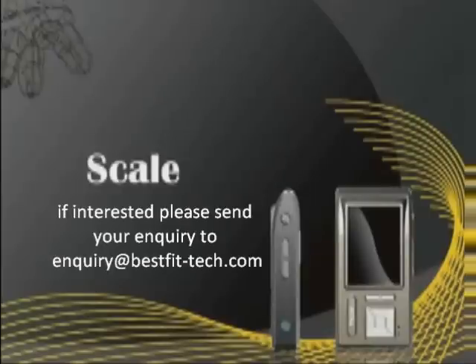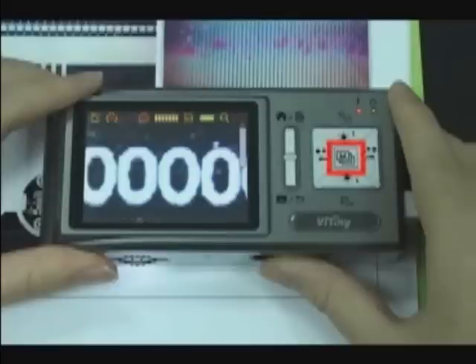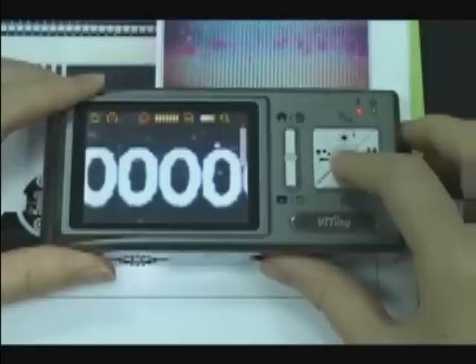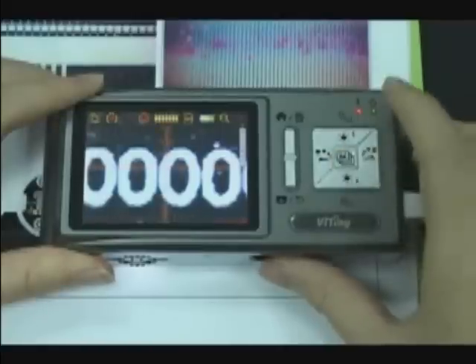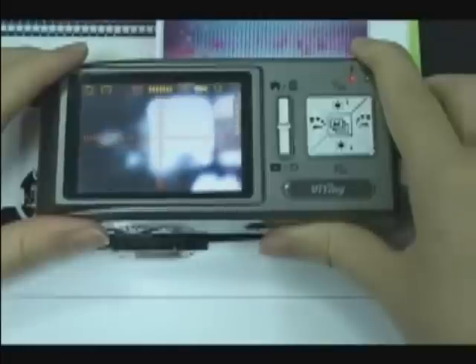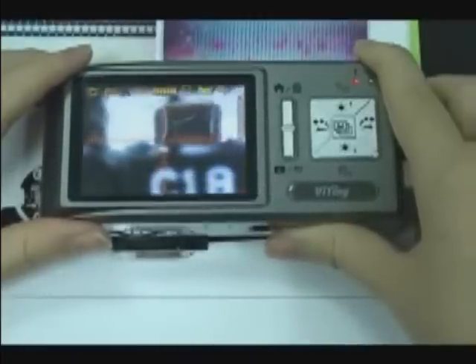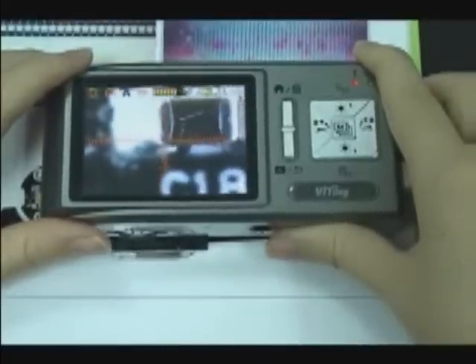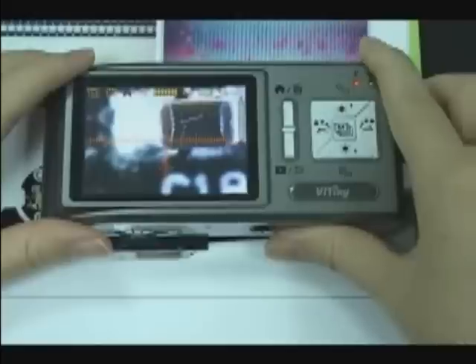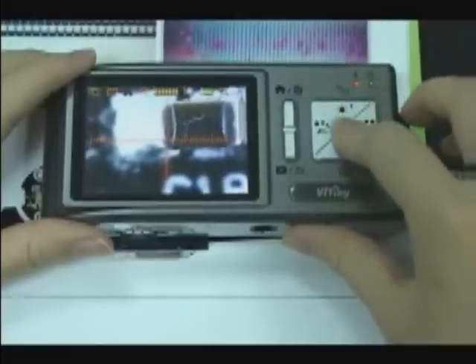Scale. Press the middle button for a long time to display the scale. Press the middle button without releasing to select different scales: L-shape scale and crossing scales. After selection, release the button. Press it again to shut down the scale.